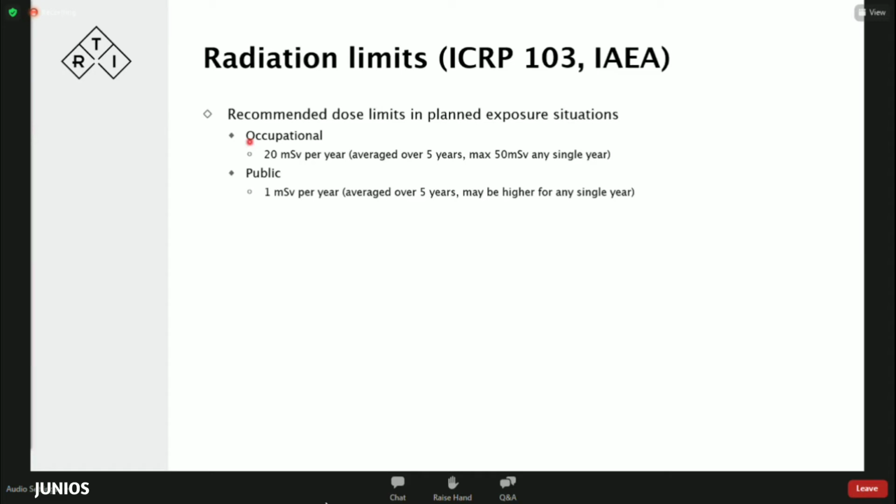For some of you who are in this webinar, you know that people like you working in hospitals are wearing what is called the personal dosimeter, or the badge, which could be a TLD or an OSL detector. So these people who fall under the occupational exposure limit have better control over accumulated exposure.